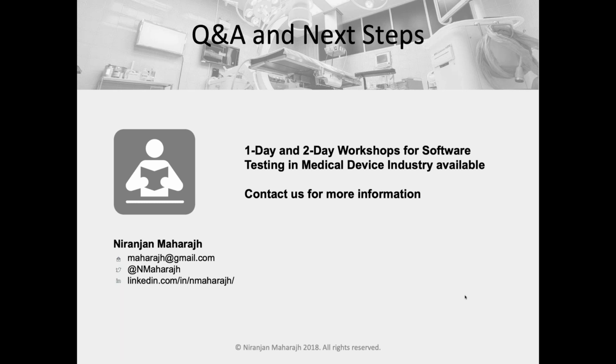This static testing is the same as what the FDA and the regulations call reviews. A big aspect that these regulations recognize is the earlier you can catch defects in your code and your requirements, the better quality product you will have. So all of those aspects map exactly to topics in this course.